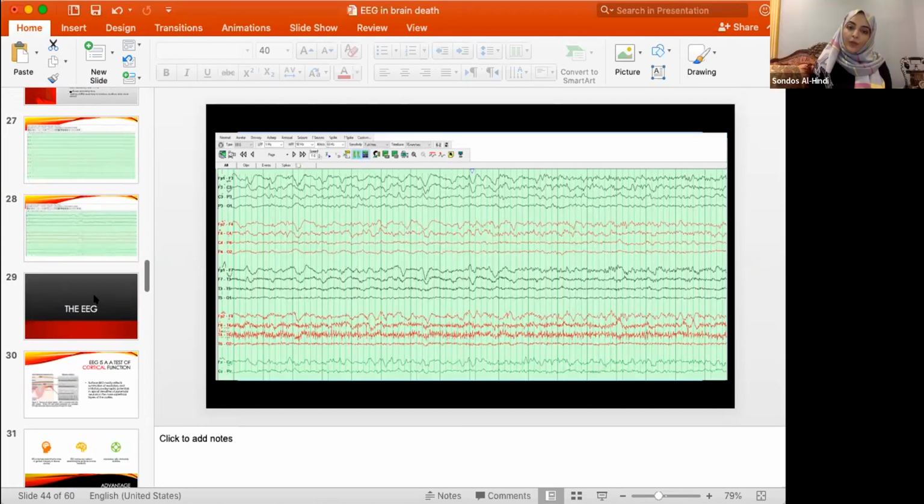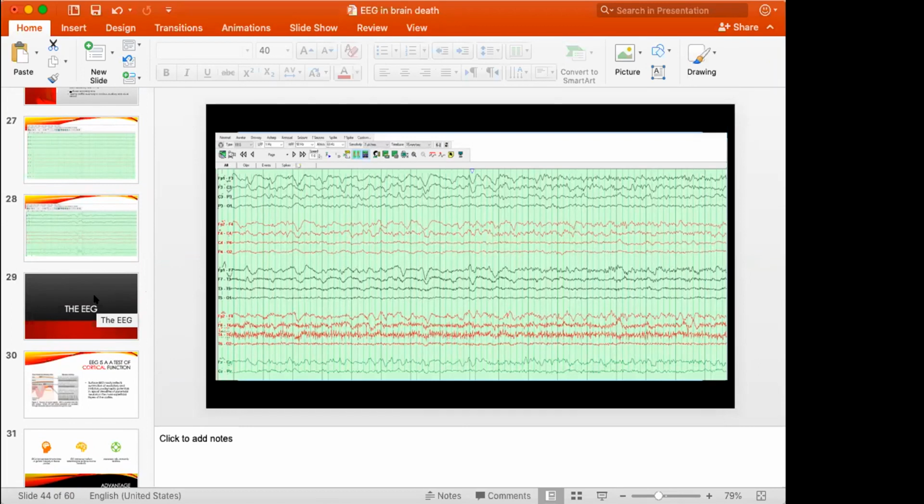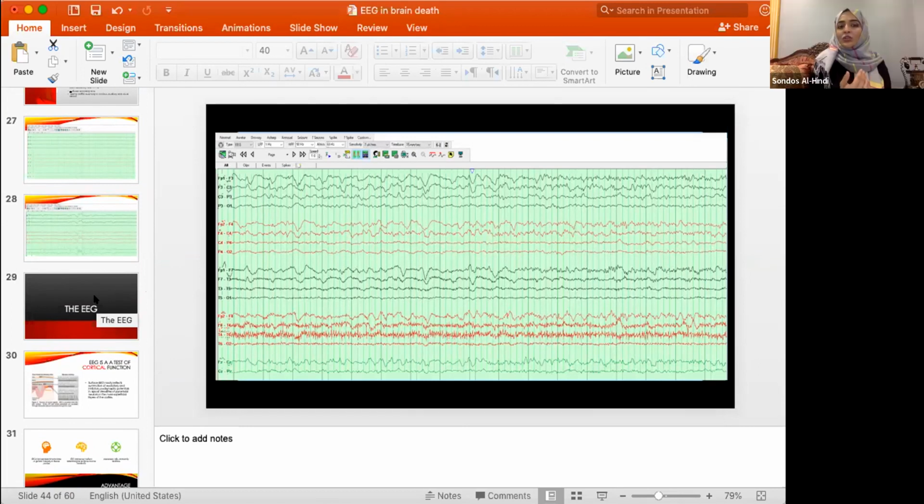You mean the non-physiological, the external artifacts? Sure. The techs try as much as possible to avoid all the external artifacts. The impedance that I talked about, checking the impedance, checking all these variabilities are very important. A good tech needs to know all these things.